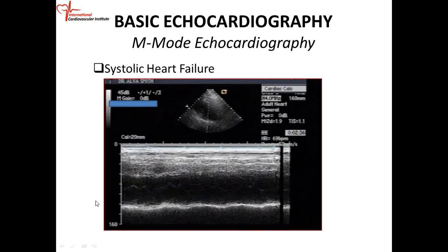All right. The next abnormal structure pathology is systolic heart failure with reduced ejection fraction. And if you look carefully, always work from first principles. I mean, some of these things you can do once you look at it. If you're seeing enough, you can quickly identify it and move on.